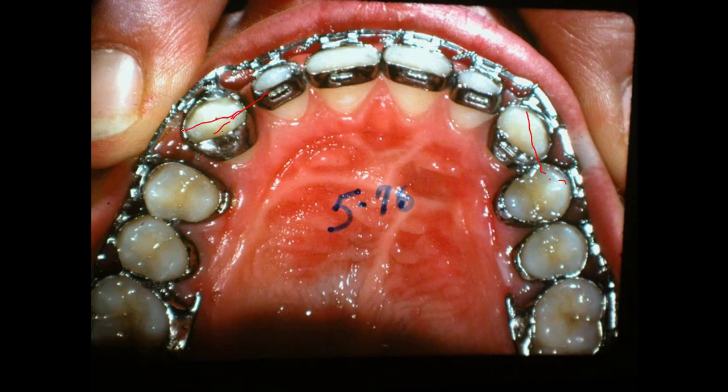This cuspid right here seems to be rotated, and I'll bring that in. I hope we did that. And here's this palate — it's got this suture that was apparently done when the child was young, and here is that defect in it. That never bothered us at all.